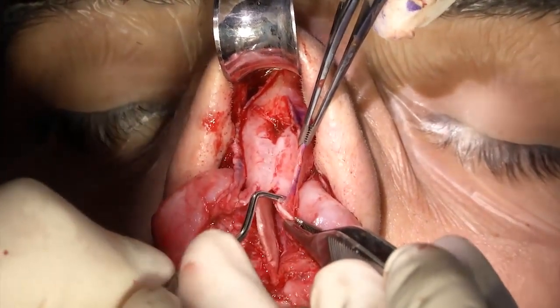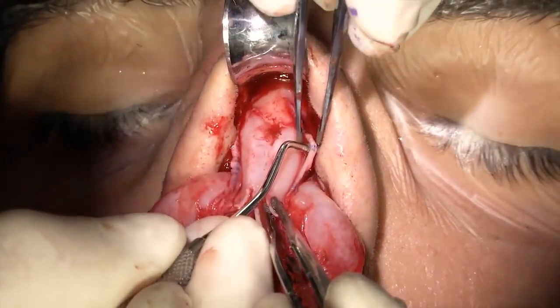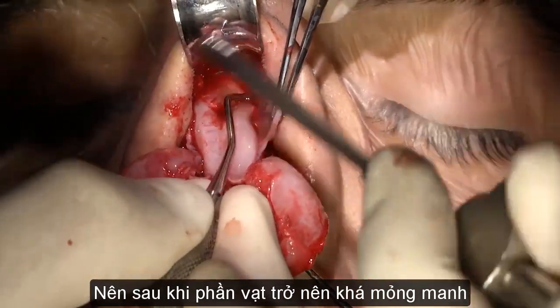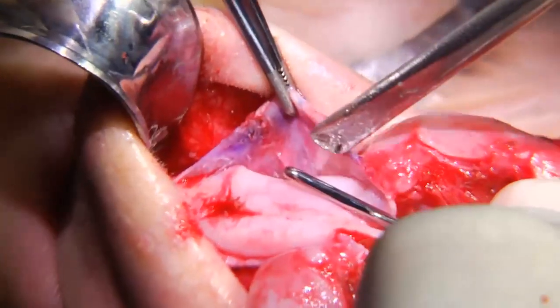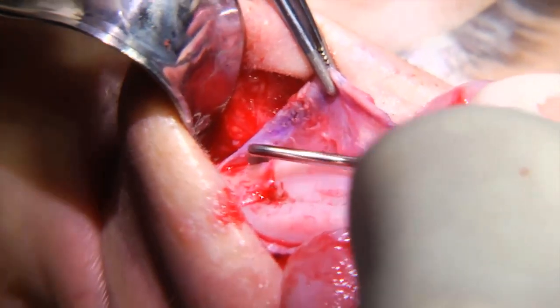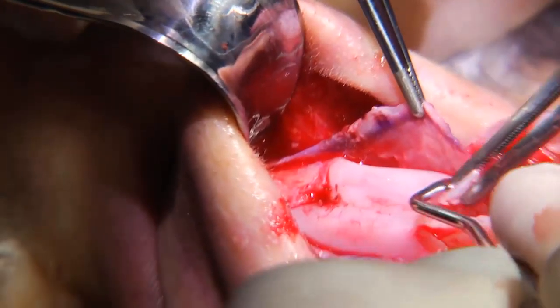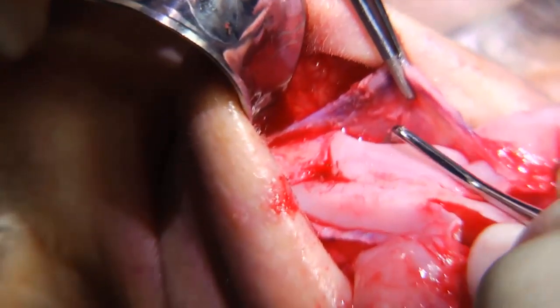Wet it, otherwise you can't see anything. Put it under tension. I'm going down a little. Turn the head toward me. So after all, it becomes really, you see, it becomes flimsy here. But on this side, I was a little bit more careful. And I was able to actually raise most of it in continuity, and that's going to be enough. So frankly, it's not that thick. I would have expected a thicker flap.